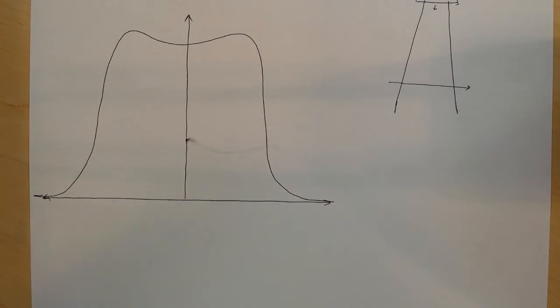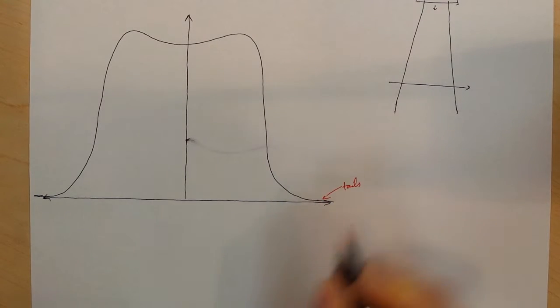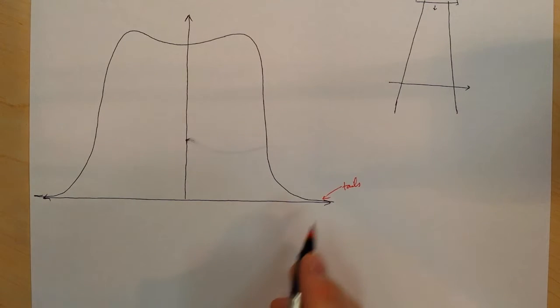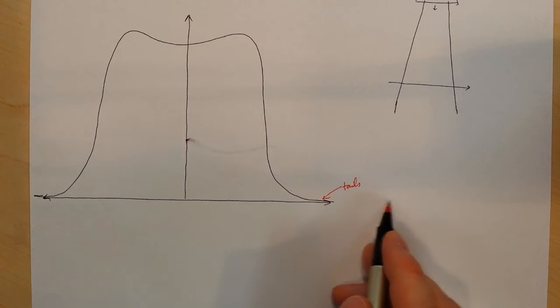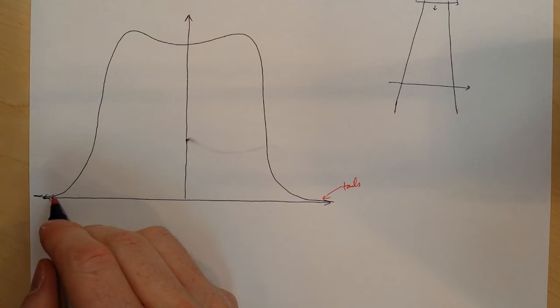And we have some specific parts of this profile. We have here, we call these the tails. There's always going to be some radiation present. There's leakage from the treatment head, and then there's also scatter radiation from inside the beam that's always going to give us these little asymptotes that go out. All right, we get a curvature up. Notice that it's not a straight line.